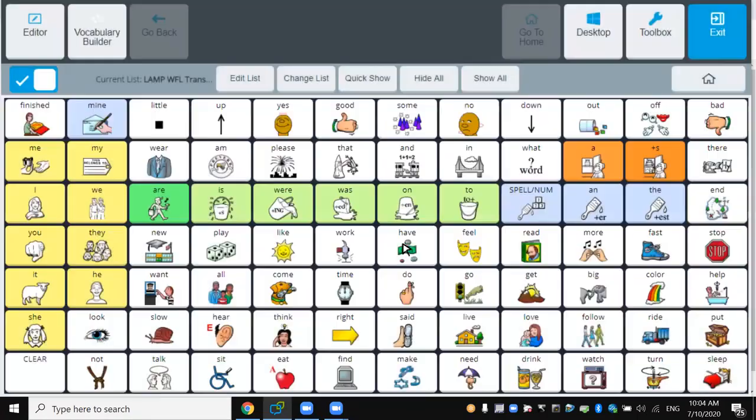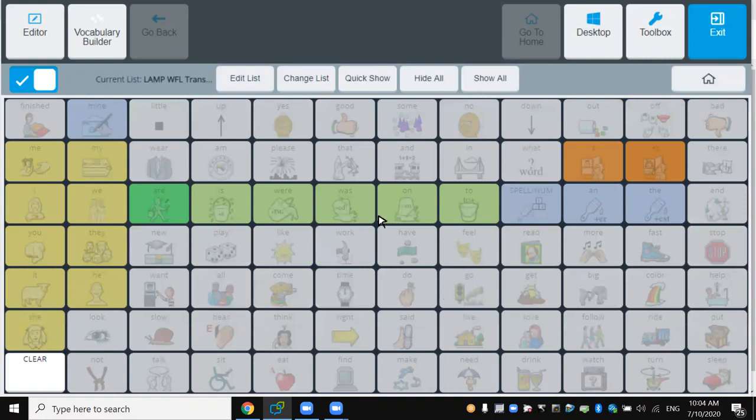Usually, forgive mine for not looking like yours will look. Yours would look like this almost every time, but it wouldn't necessarily every time. So you hit Hide All if you have to get everything gray. That's the way it'll show up the first time. Now that it's on, because it's blue and everything's hidden, you can now highlight or touch the words you want to work.